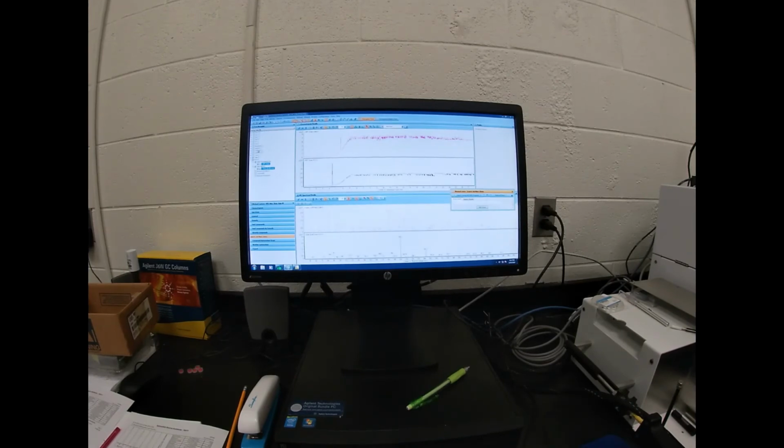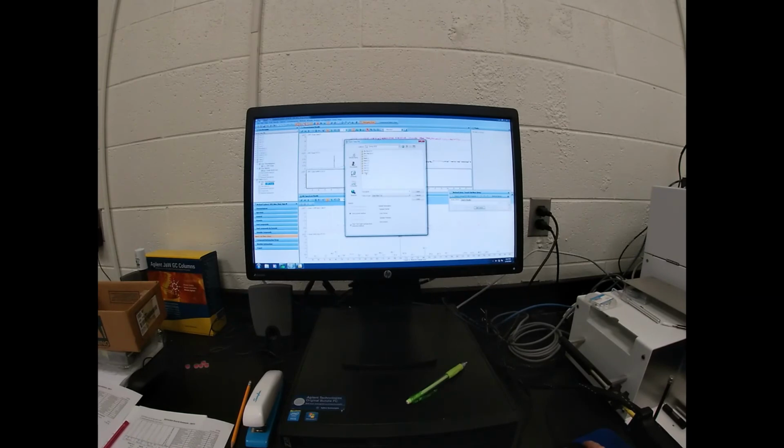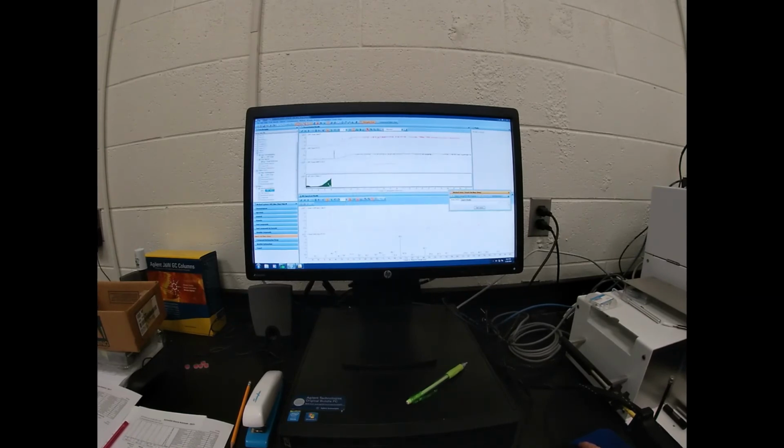What else do we think they had? More methamphetamines, I believe. All right, this is from that original spot testing. Where's our meth? Meth. I don't know why it's stuck in the wrong folder. And so again, with meth, we need to do our total ion chromatogram extraction.